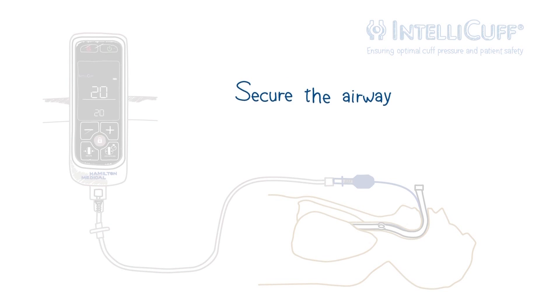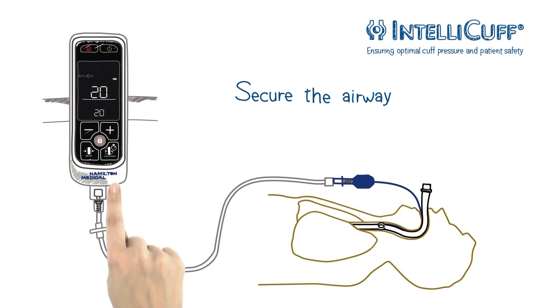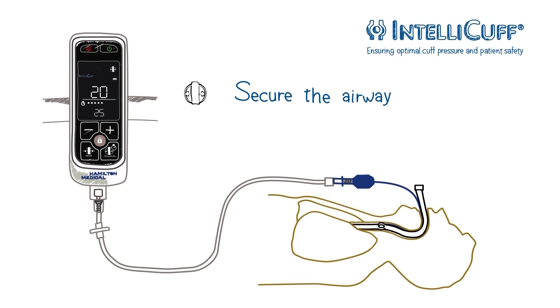Increase the cuff pressure for a user-defined period of time to secure the airway and avoid aspiration or unintended extubation. By default, the hold is active for 5 minutes and applies 5 cm of water above the currently set pressure. You can stop the hold at any time.